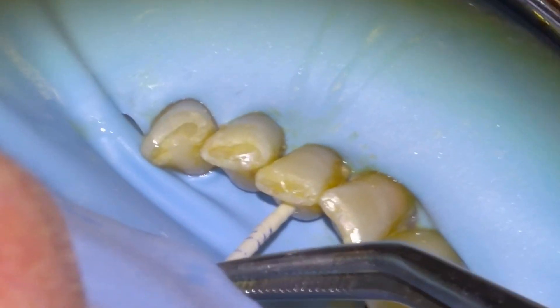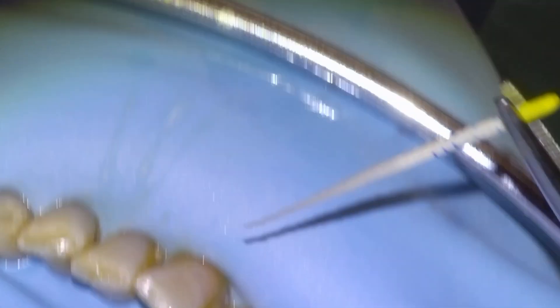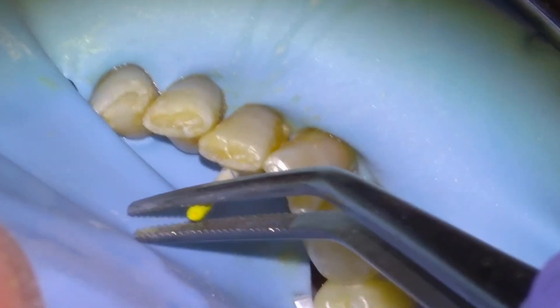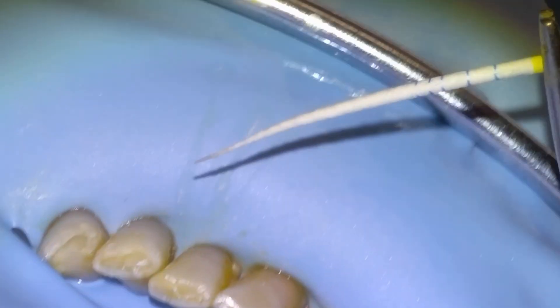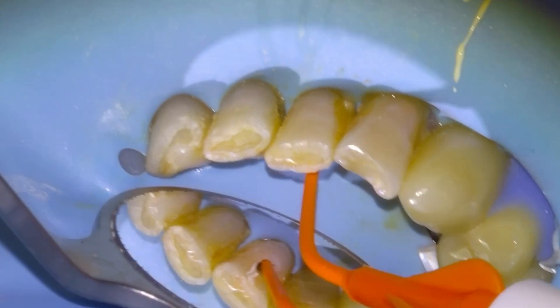Then irrigate, activate, and start drying the canal with F1 paper points. The first paper point comes out wet, the second paper point comes out mostly dry, so that'll be good. We'll take our bioceramic sealer tip down as far as we can get it.